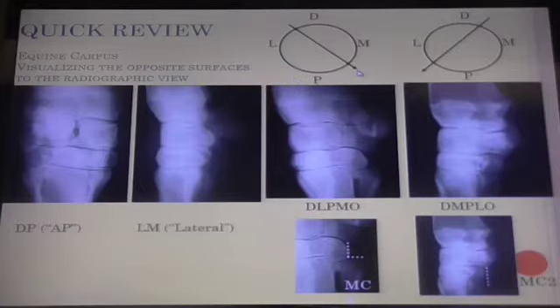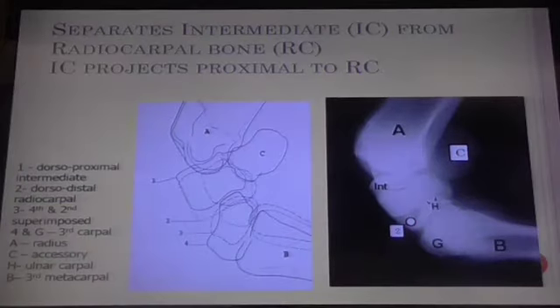Okay, so I think we all got that pretty good. We talked about the L lateral. L matches the second letter L, lateral oblique. So you're actually looking at the palmar or plantar-lateral surface. And remember when you call the view, it's a 360-degree circle based on the entrance and exit of the view. Okay, great.